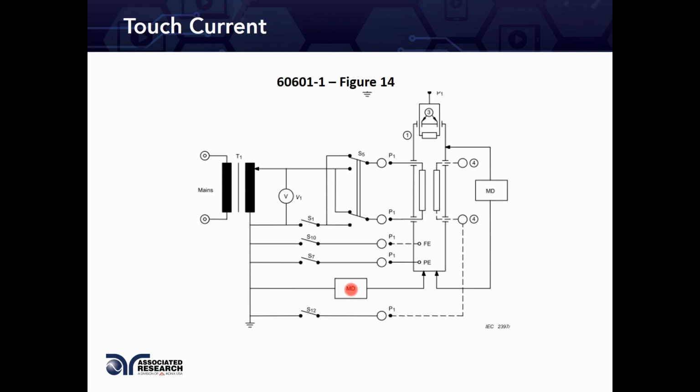The reason is that at a particular voltage, at a particular current more than 10 milliamps, there's a possibility that the person can't let go anymore. The muscles react to current higher than 0.5 milliamp. 5 milliamp is kind of a shock hazard, and at 10 milliamp it's possible that the muscle starts contracting, with inability to let go anymore. So having a small amount of leakage current on the chassis allows a dangerous condition of shock hazard.